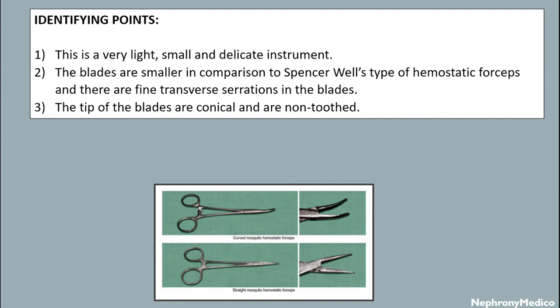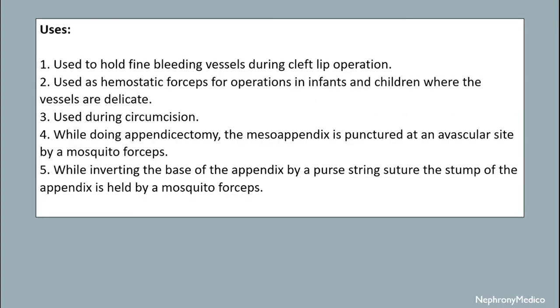There are fine transverse serrations in the blades, and the tip of the blades are conical. It is a non-toothed instrument. Its uses: it is used to hold fine bleeding vessels during cleft lip operations, and used as hemostatic forceps.